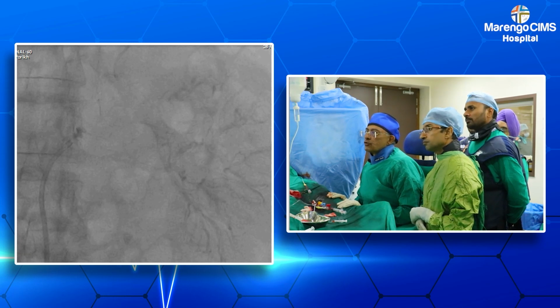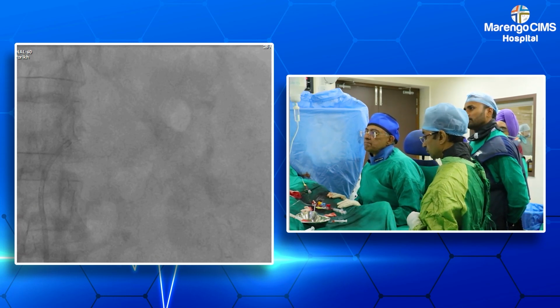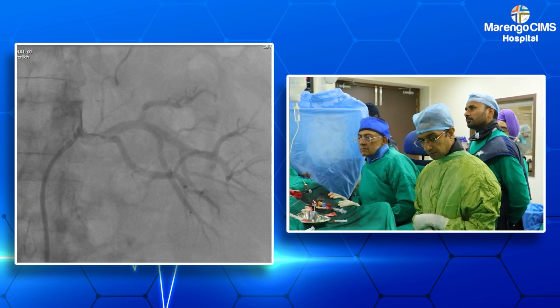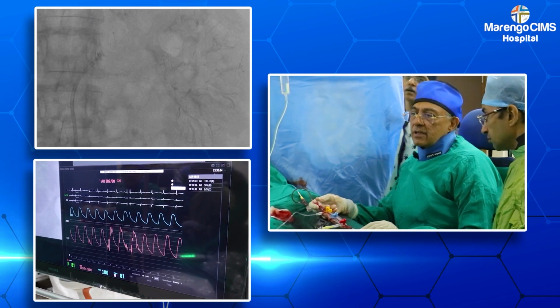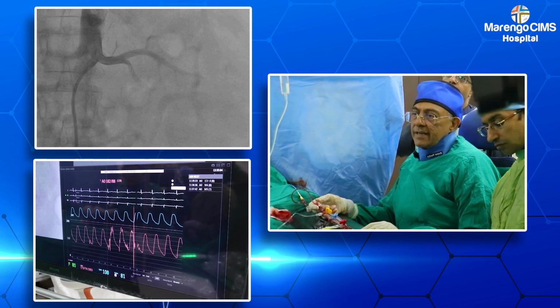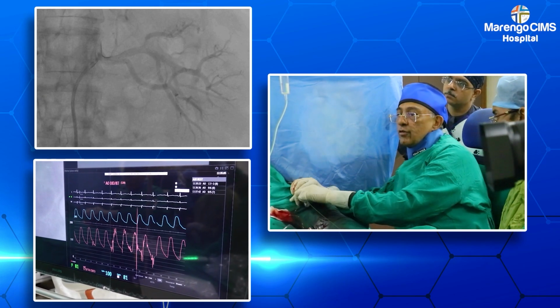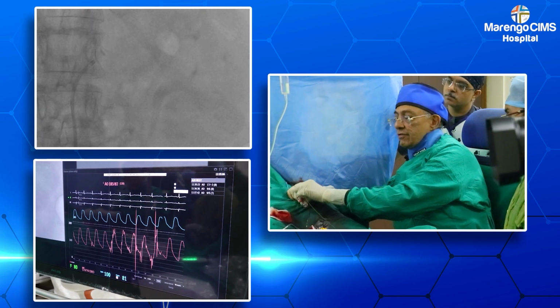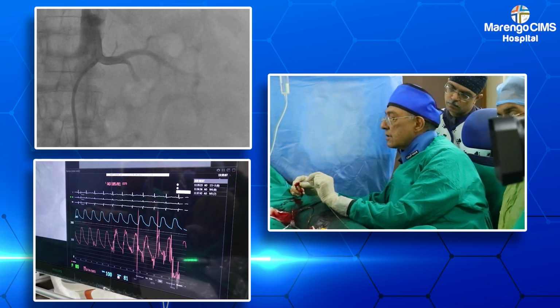Post-procedure angiography looks good, all the arteries are intact, no unusual areas. Yeah, right. Last blood pressure is around 180, but she's now awake with some degree of discomfort, back pain. We'll remove everything out and we'll use Angio-Seal to close the 6 French side.